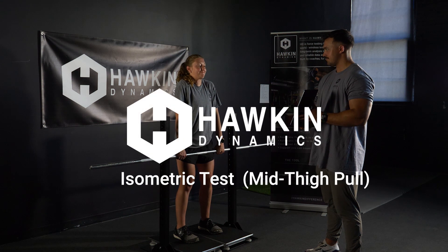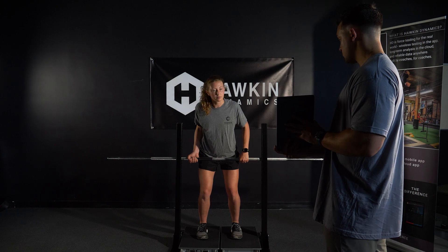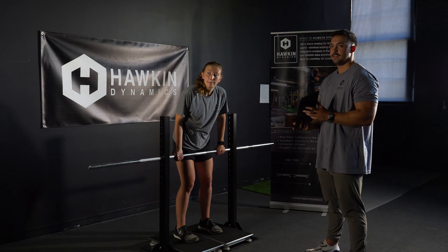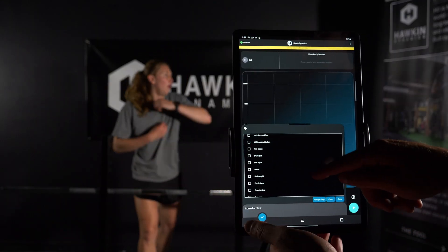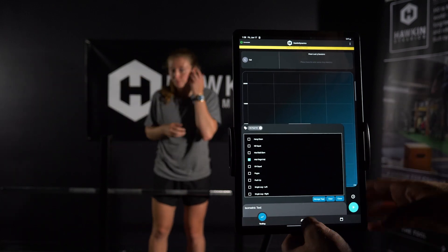In order to perform the isometric mid-thigh pull, first determine your setup. This can be set up in a rack or with a custom isometric rig. Once set up, instruct the athlete to step onto the plates. Select the isometric test from the bottom left of the screen. Adjust the bar so that its location is comparable to the second pull position of the clean.